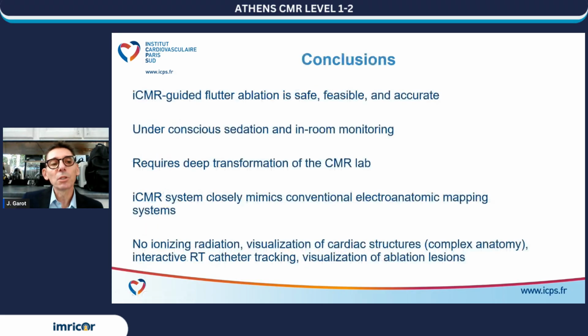So in conclusion, the interventional CMR-guided flutter ablation is a safe, feasible, and accurate technique. It can be done under conscious sedation and in-room monitoring. It requires deep transformation of the CMR lab. The ICMR system closely mimics the conventional electroanatomic mapping systems. What is really interesting is there is no ionizing radiation.